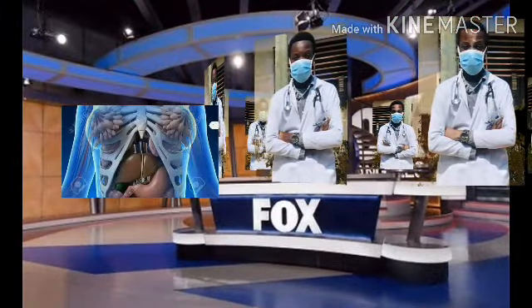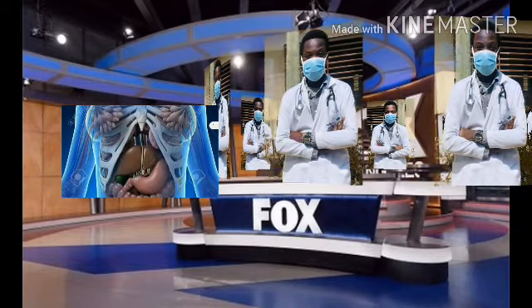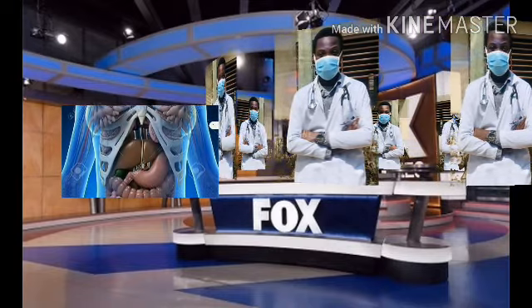Clinical examination of the respiratory system. Breath sounds. Let's look at auscultation.